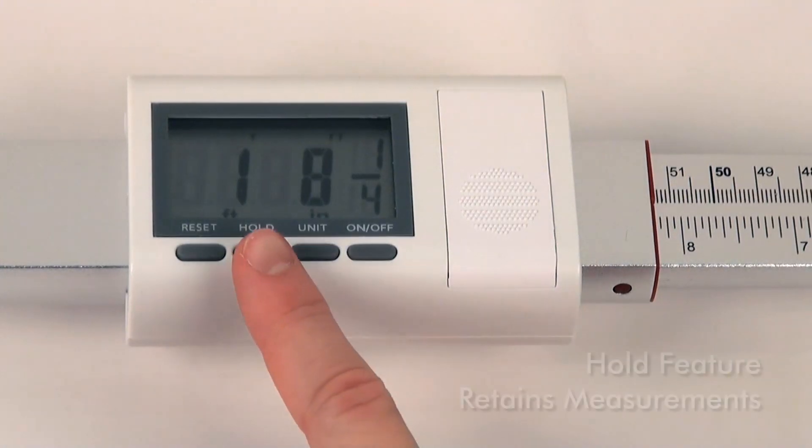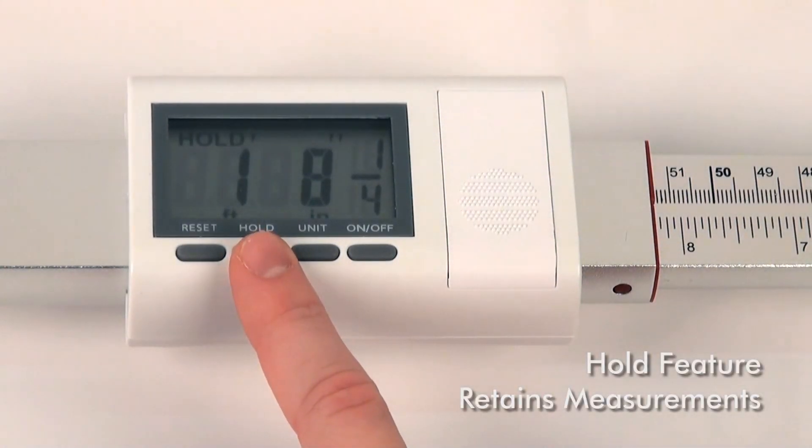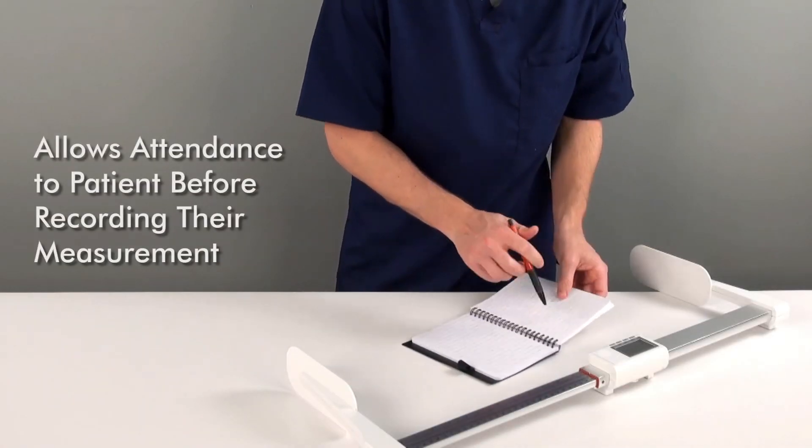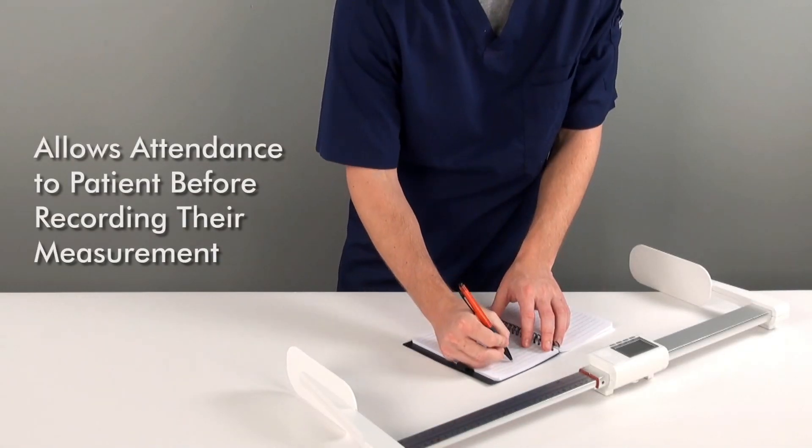which are included. The convenient hold feature allows measurements to be retained on screen, so the healthcare professional can attend to the young patient first before recording their measurement.